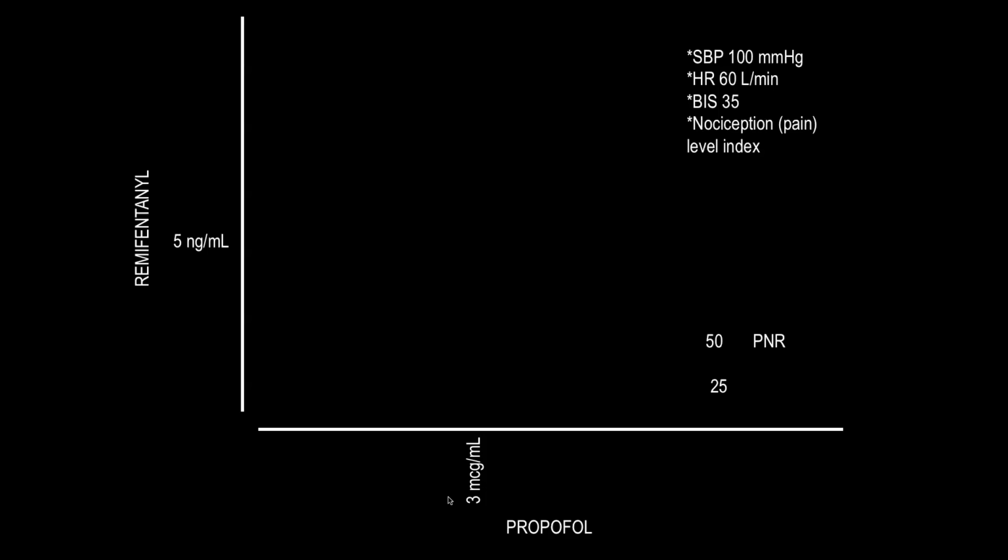The patient is in a plane of adequate analgesia, but probably on a plane of hypnosis greater than required. Considering the supra-additive interaction of both drugs, if the anesthesiologist modifies the infusion of the hypnotic, he must also modify the remifentanil so that the patient continues in the same nociceptive plane and decreases the hypnosis plane.